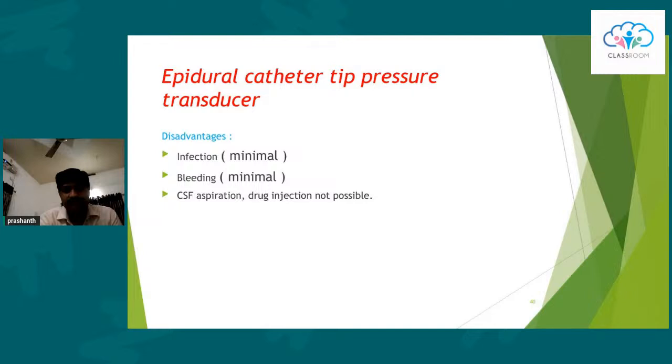Then you have the pneumatic epidural catheter. Most of these systems are of historic interest. The standard is to directly go for an intraventricular catheter or for the intraparenchymal catheters.